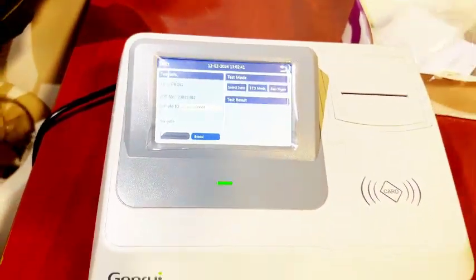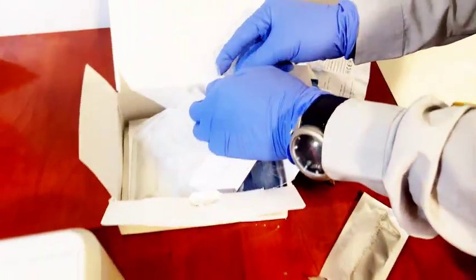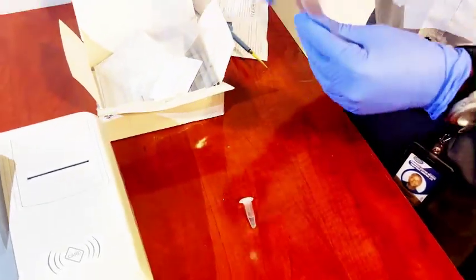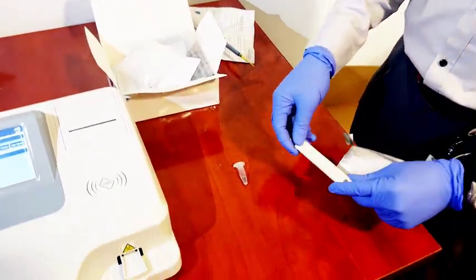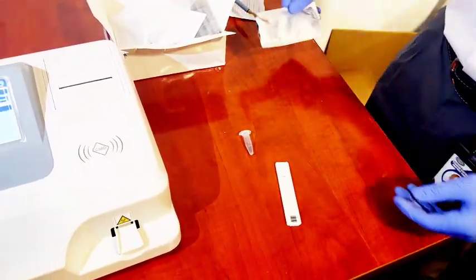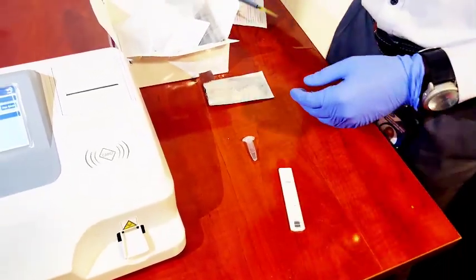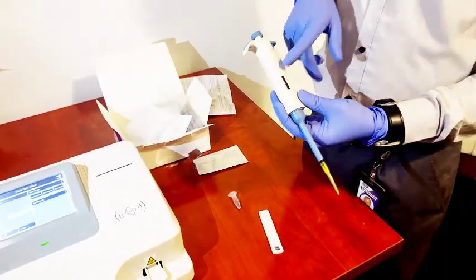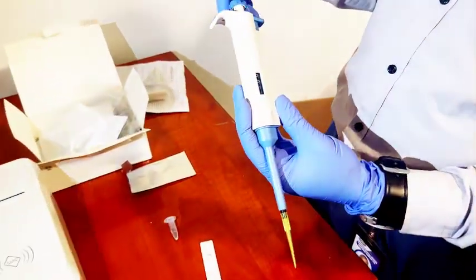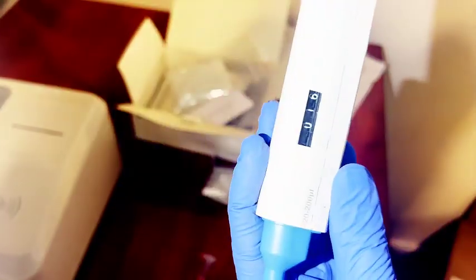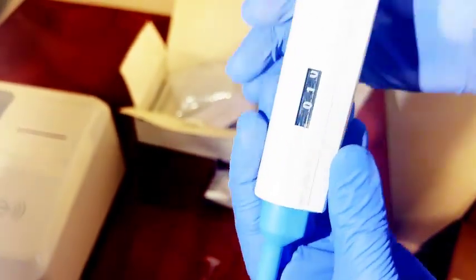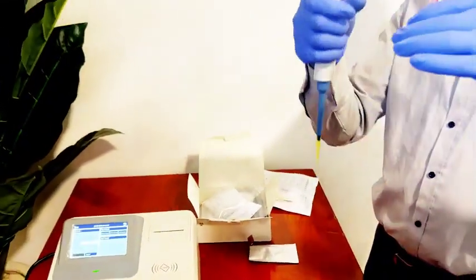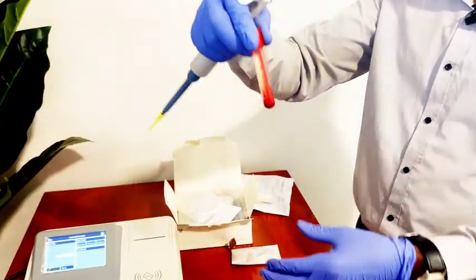Then come here and bring out your reagent and your cassettes. These are our Progesterone cassettes. We also have our pipettes. Since we are using whole blood, we set our pipettes to 10 microliters. This is our whole blood sample.